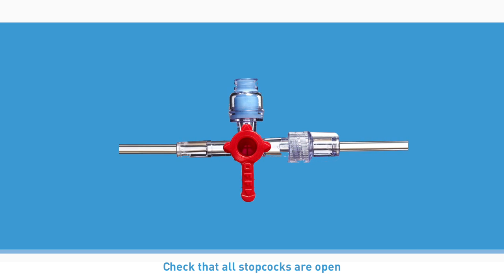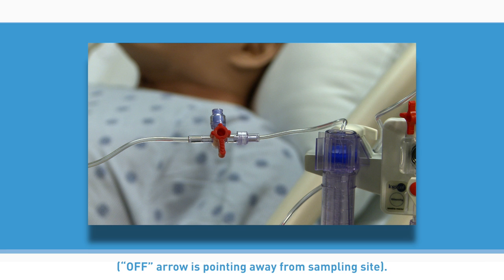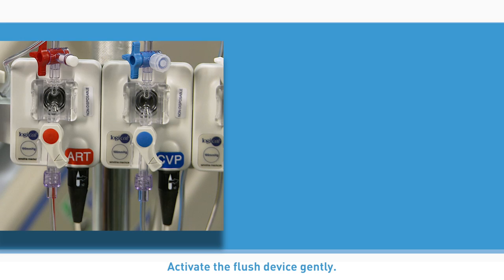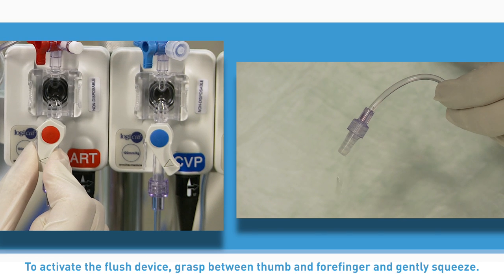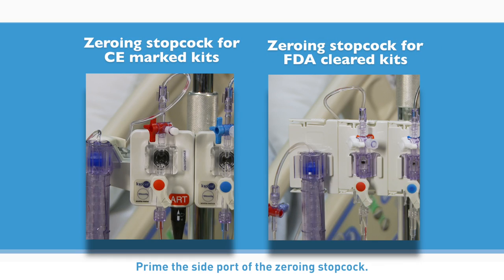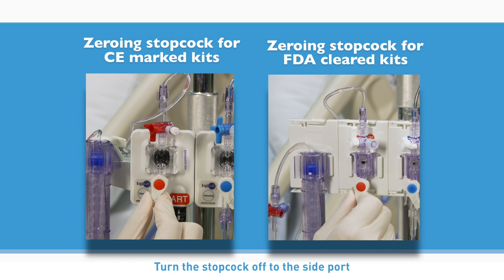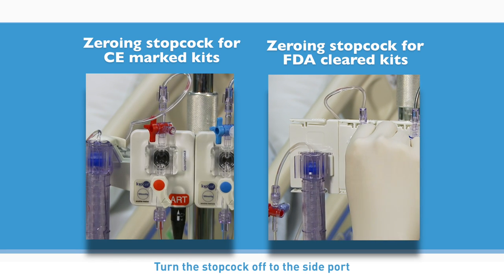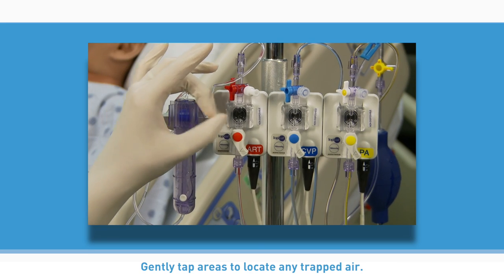Check that all stopcocks are open. When the system has two sampling sites, the distal sampling site stopcock must be open — the off arrow pointing away from the sampling site. Open the roller clamp. Activate the flush device gently. Remember, air rises — always allow the fluid to fill from below. To activate the flush device, grasp between thumb and forefinger and gently squeeze. Prime the side port of the zeroing stopcock. Turn the stopcock off to the side port and close with a non-vented cap. Gently tap areas to locate any trapped air.